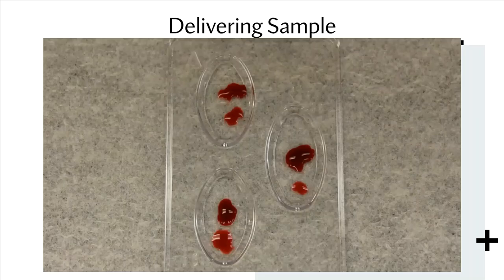So again, do not freak out, but here I've zoomed in a little bit closer to the blood wells so you can see them. I've also put them more in focus so that you can see me getting ready to add the anti-serums to them.